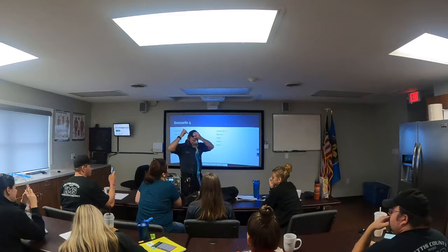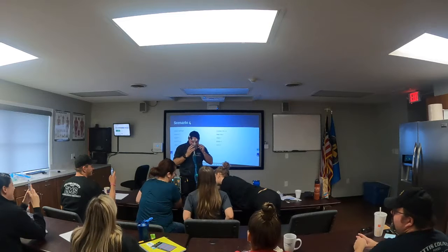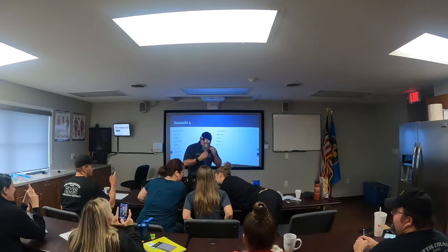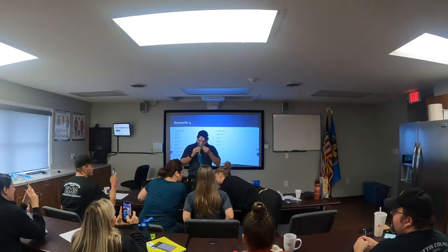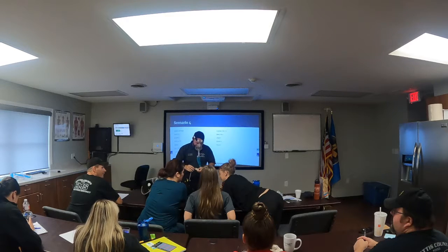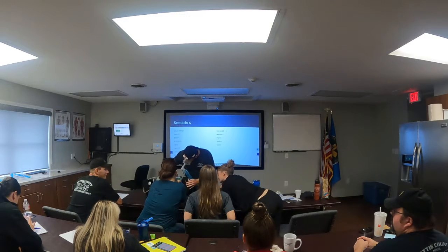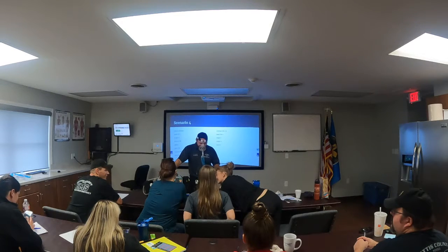Okay, what do you currently see on the monitor? Tidal volume is 712. You're breathing so fast. He's nervous.